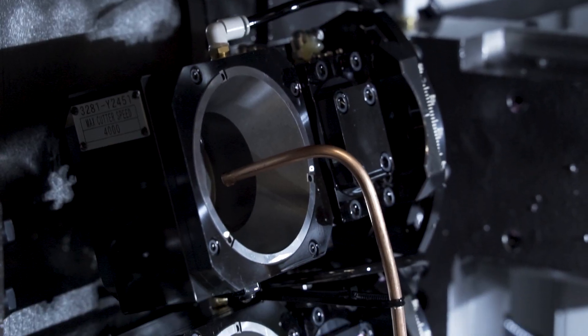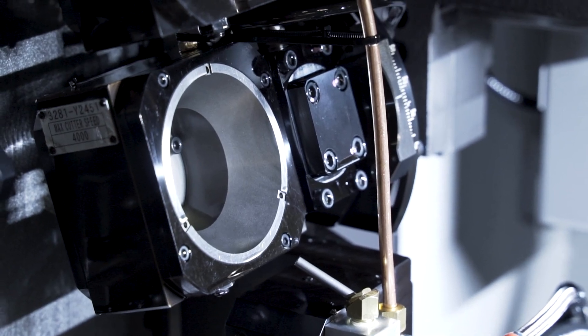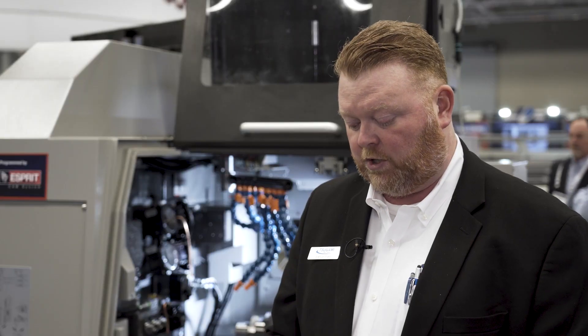One of the really unique things about this model machine is that it has the capability of storing two thread whirling units at the same time. A lot of 20 millimeter Swiss turn machines would only have room for one. This allows us to cut multiple thread leads — either on a family of parts with different sizes, or on a single screw that has more than one thread lead, which is becoming a trend in modern bone screw manufacturing. In the past, somebody might have had to use a slower single point threading process to create the second thread.